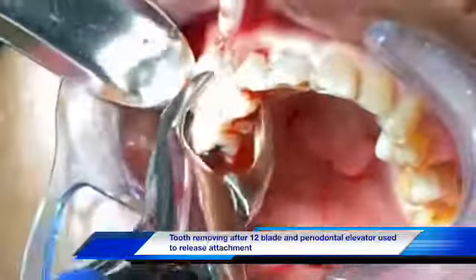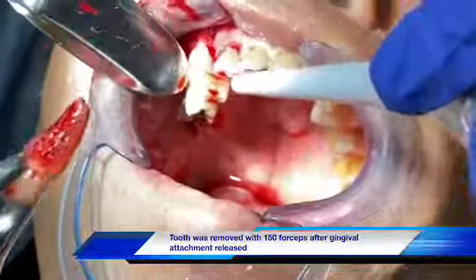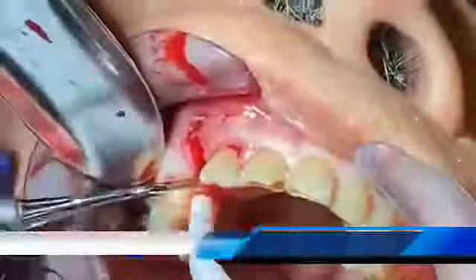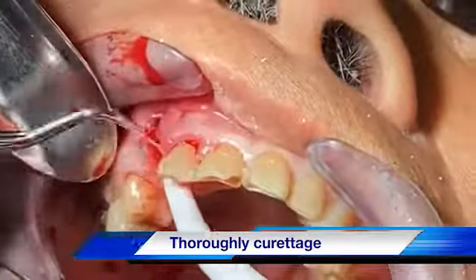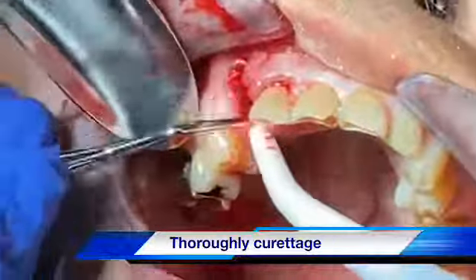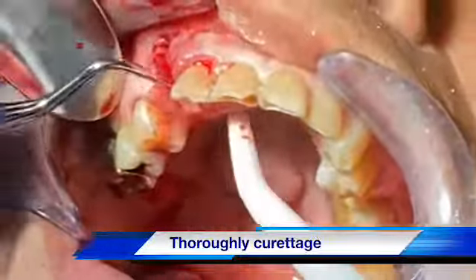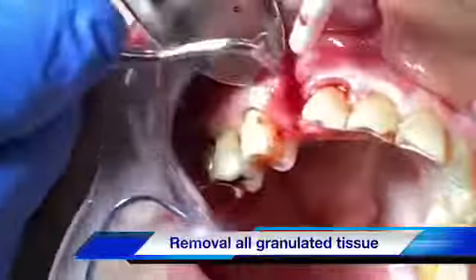The first thing I have to do is release using the blade and just release the tooth so that I can gently take it out in a way that I don't tear off more of the gum. So after releasing with the number 12 blade, I just now take out the tooth.